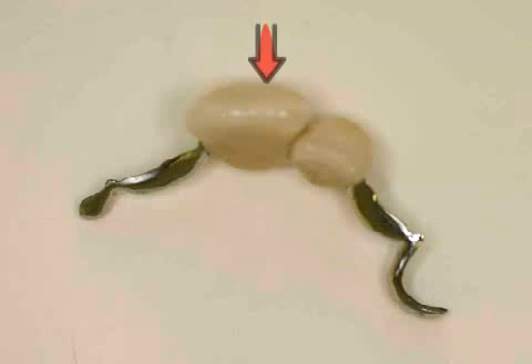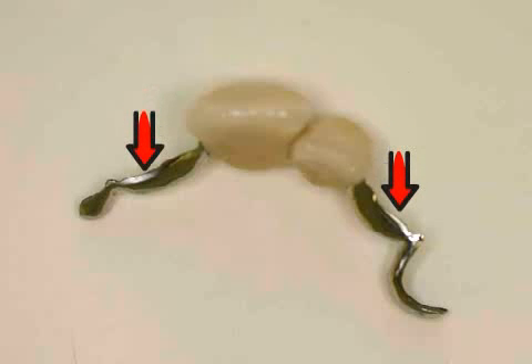The term Maryland Bridge refers to a fixed prosthesis which cannot be removed from the mouth. What makes this bridge special is that the surrounding teeth do not need to be sanded. The metallic grips are affixed to the insides of the surrounding teeth.